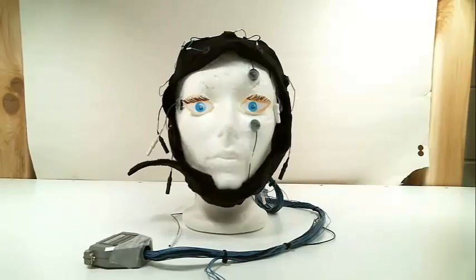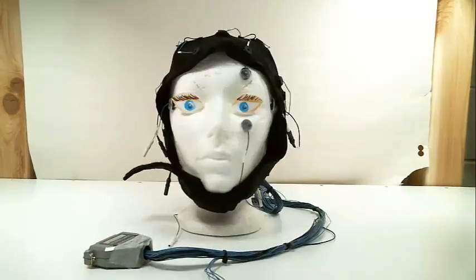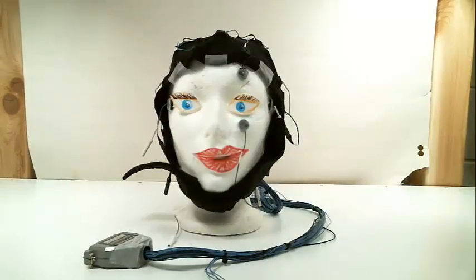Eyeball the cap to make sure the electrodes are in straight lines. Then re-measure the head to make sure your middle electrode didn't move. Over time, these caps can lose some elasticity and we often use tape or mesh to keep the caps tight and the electrodes against the scalp.